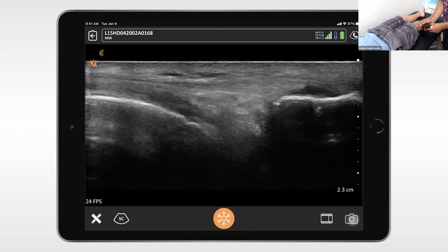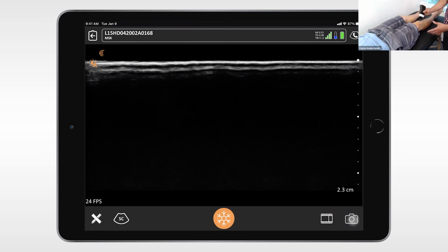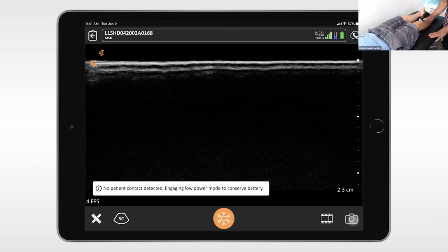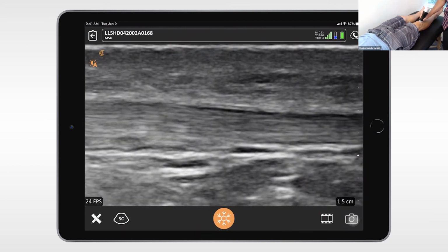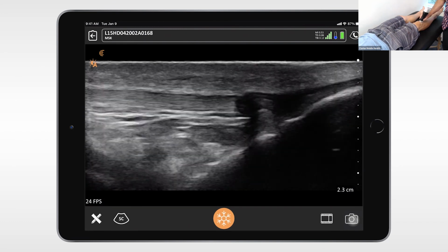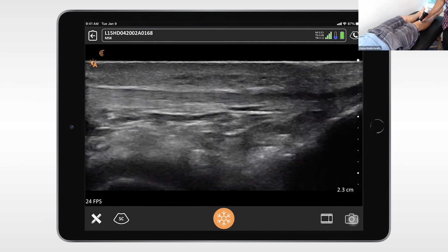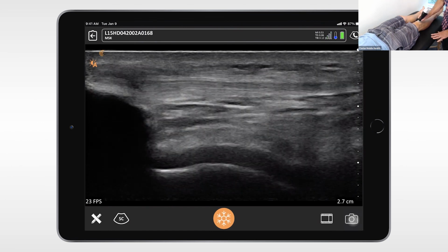Right. Yeah. So for someone coming in with knee pain, being able to assess some of these structures matters. We usually rely on clinical tests that I find have pretty poor sensitivity and specificity, even in the best hands. To just add the imaging to augment my physical exam is so powerful, to actually see really what's going on. And this is the scan you were doing, right, showing us the patellar ligament, right? So here we go.